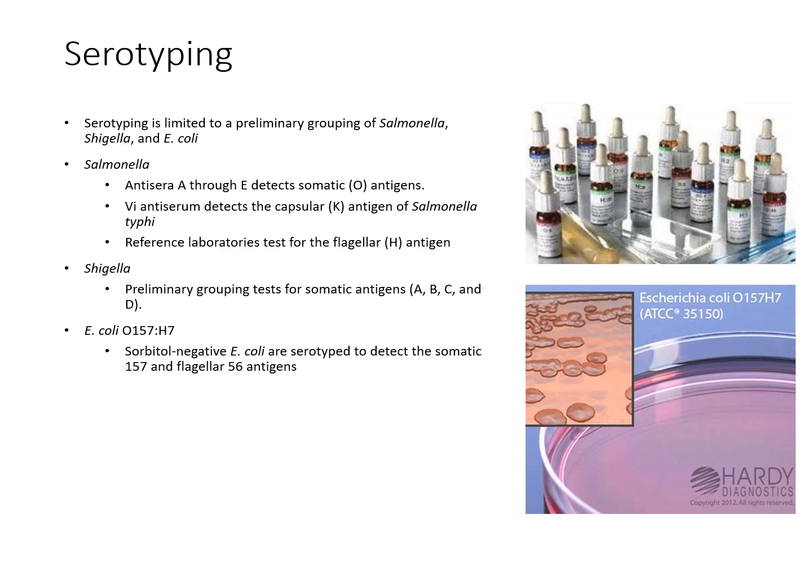And then you're also looking for that capsule, that K antigen. And so a lot of times, depending on the particular lab, you may see this more in reference labs than you would just a hospital lab. Because this would be so specialized, you wouldn't really see this that often to be able to need to serotype these. So this may be something that would be sent to like the CDC or the state lab.